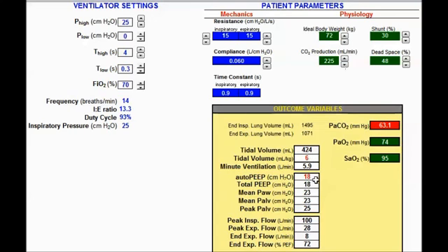However, you notice I have a lot of auto PEEP still. So 18. And if I decrease it any more, I'm just going to create more auto PEEP. So there it's maximized. I have my tidal volume in the 4 to 6 cc's range, and that's as low as I can get on the auto PEEP. If I go up, I start sacrificing my tidal volume.